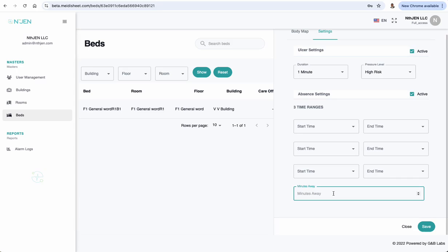What we are saying is that if they leave the bed, go someplace, fall, or wander off into the hallways, then the alarm should go off, not when they leave the bed.